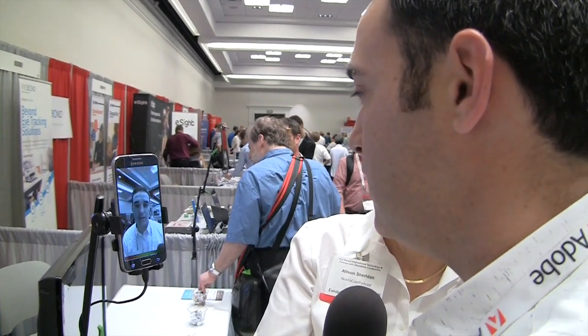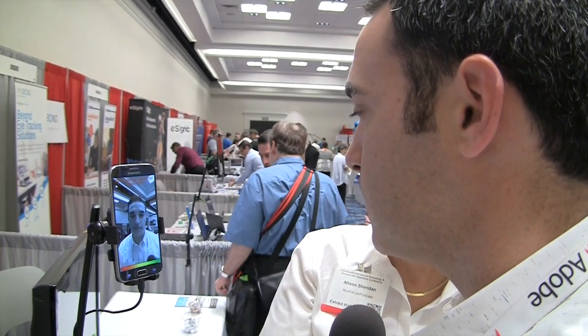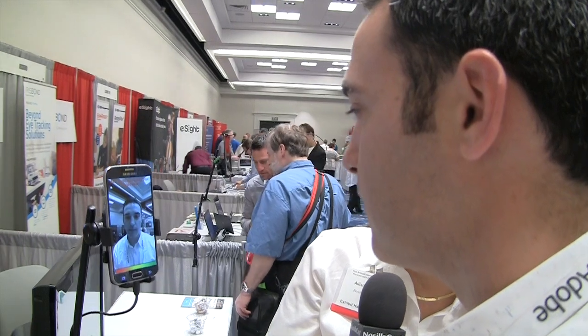We're going to do a demonstration. Since this is both audio and video, Oded will describe what he's doing for those who can't see. To turn the device on, you say 'Open Sesame' and it turns on and searches for your face. We're now seeing a camera view looking at his face — it just turned on.